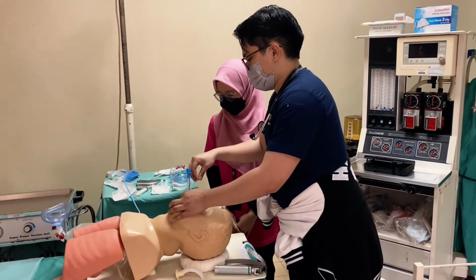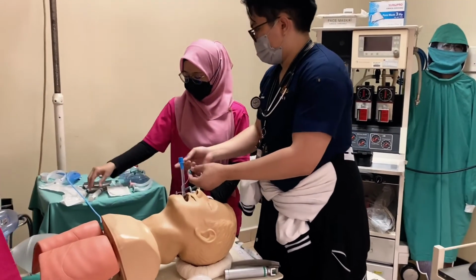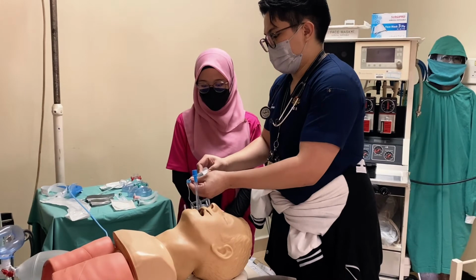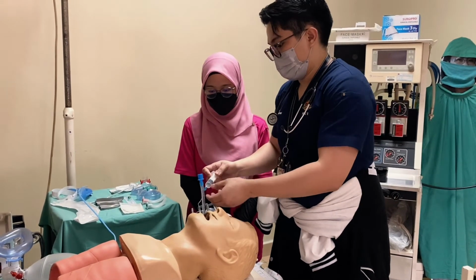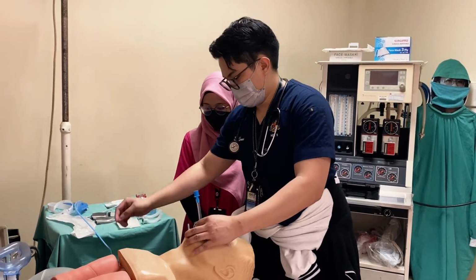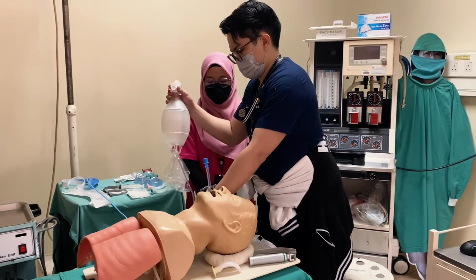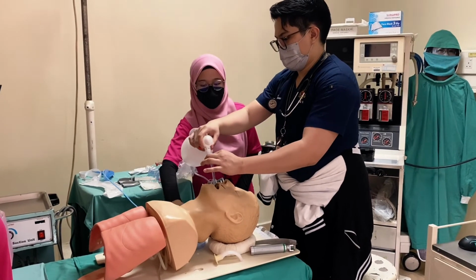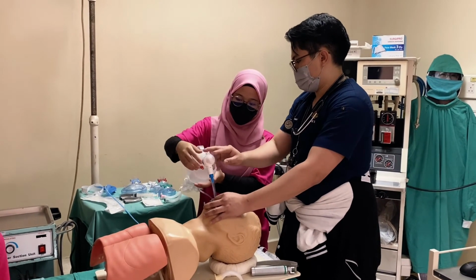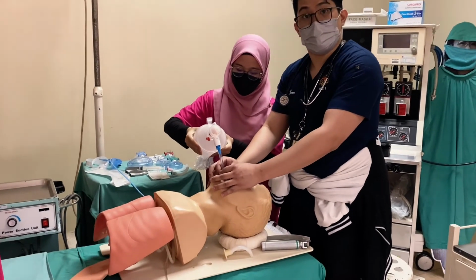Then after that, the next step is to make sure that we can ventilate. Our assistant will give pressure towards the cuff, for instance. For now, I'm only giving it as an example of how we do it. Then after that, for now we'll be using this bag valve mask to provide it. We ask our assistant to hold it. Come. Ventilate it. Bag it. Okay. This is the example that we'll be doing.